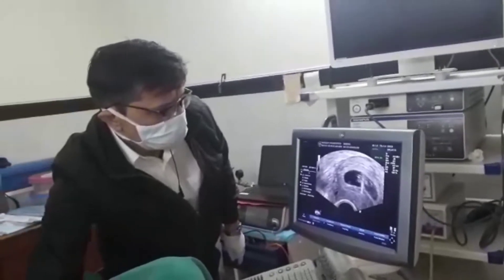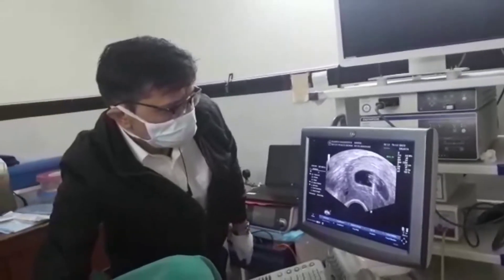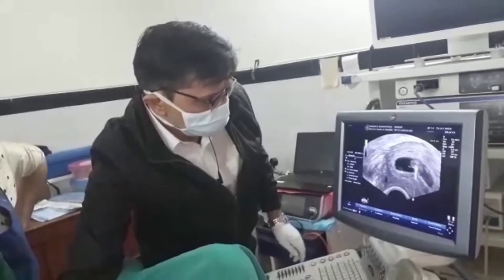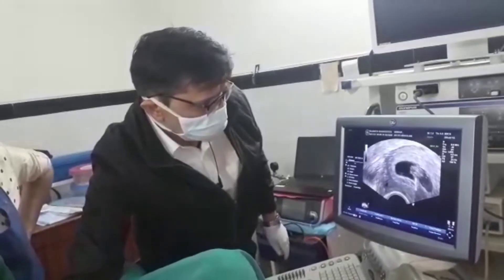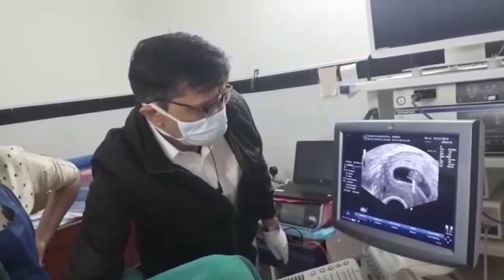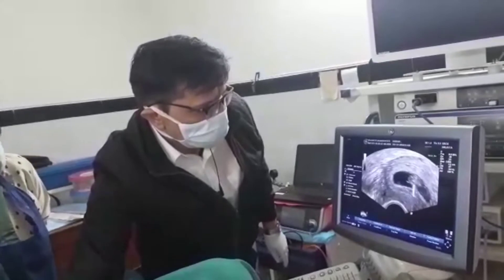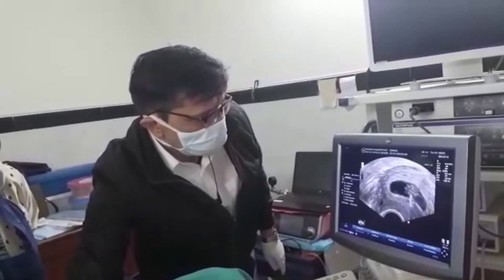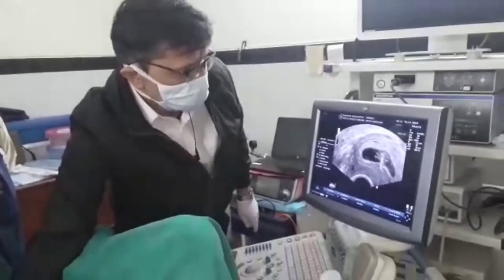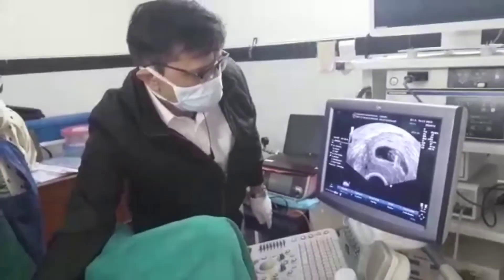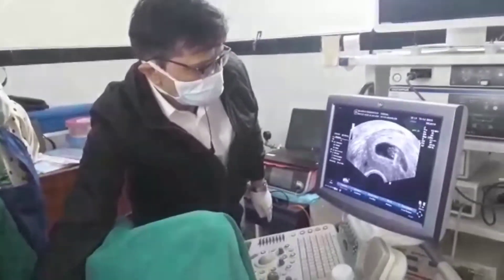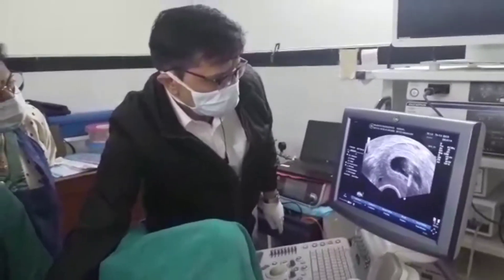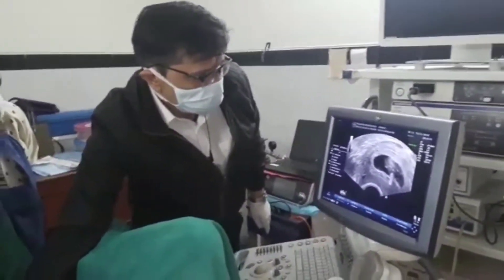This is the way we do fetal reduction in cornual pregnancy. We can also do this with live ectopic pregnancy to prevent laparoscopic removal, laparotomy, or impending rupture. We are visualizing as we instill the KCL drop by drop until we see the heart stop.